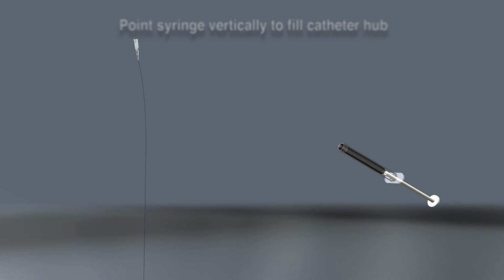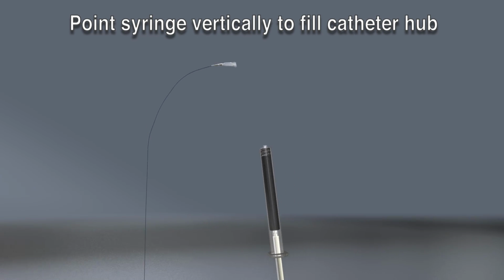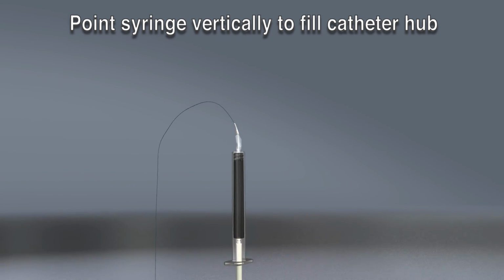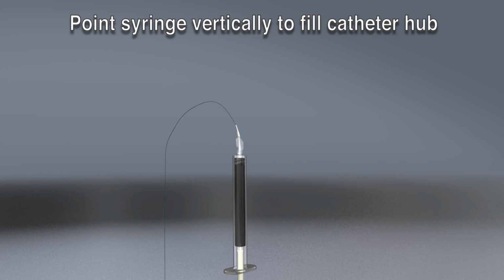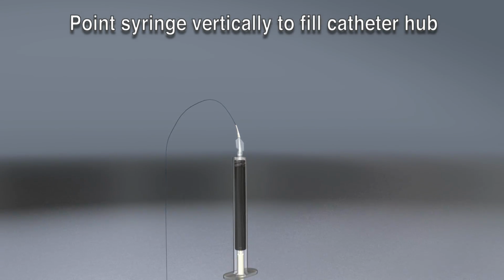Immediately, take the ONYX syringe and point it vertically with the tip pointing up. Invert the hub of the catheter and connect it to the ONYX syringe, making sure there is no air in the hub during the connection. Be sure the luer does not contact any saline, blood, or contrast. To avoid ONYX dilution with DMSO, continue to point the syringe vertically. Begin injecting the ONYX to displace the DMSO.